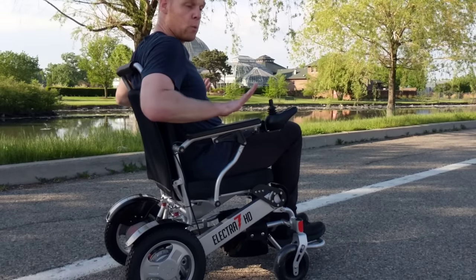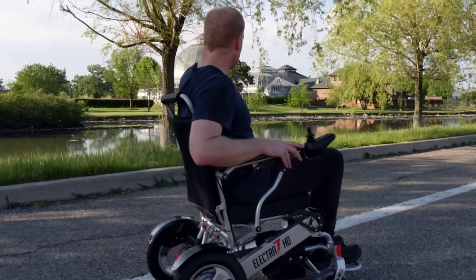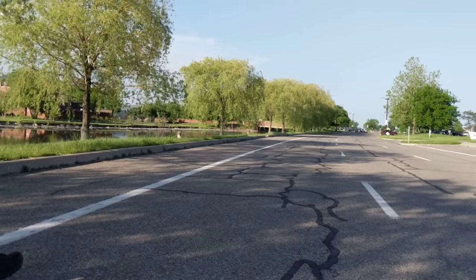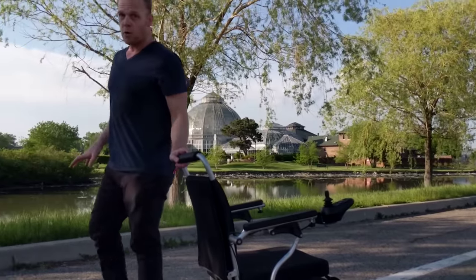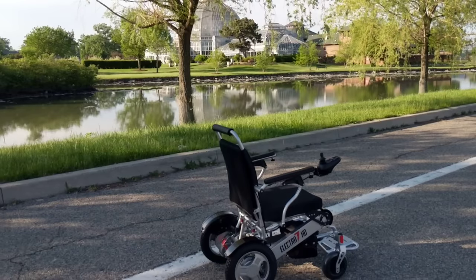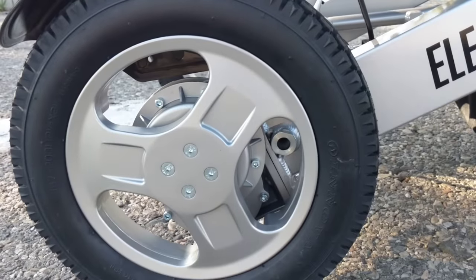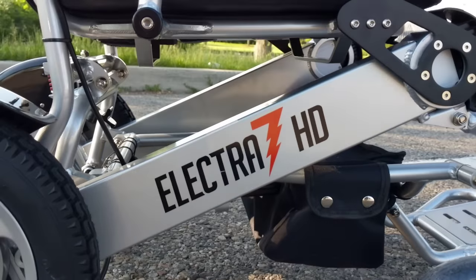You can go anywhere you want to go with this chair that's outside and has a nice flat surface. You can go on the grass that you can see behind us. The manual will tell you no grass and to keep it on the cement — they don't know if you're going to drive the chair through a rabbit hole and decide there's a lawsuit. So technically no grass, but the chair functions absolutely marvelously in the grass.